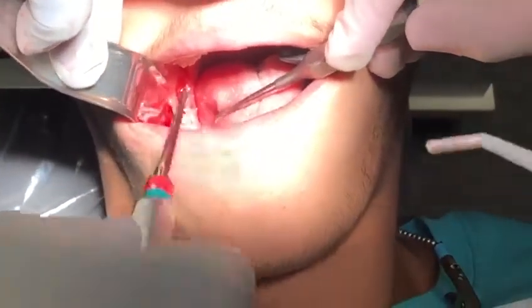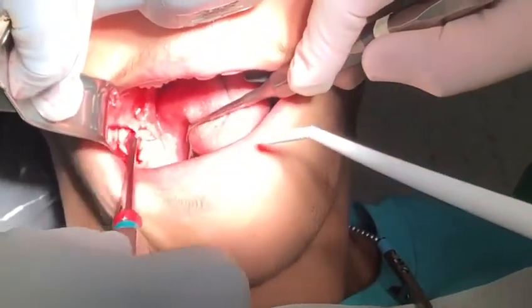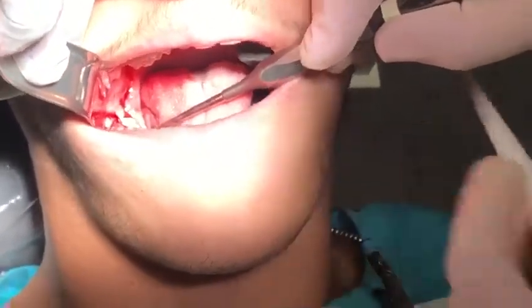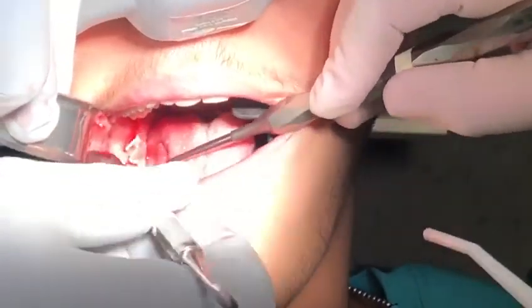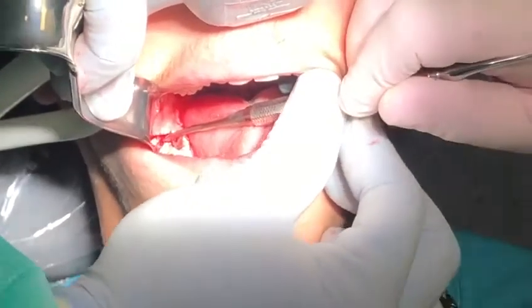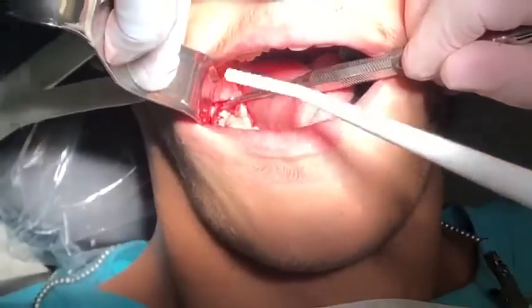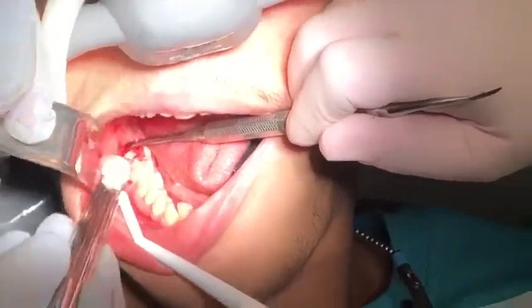Can you feel it? Try to lift it up at all. It's going to look like it's impacted — really tight — so let me have a look at it. See if you can hold this right here. Lots of water and a little vibration you're going to feel here. No worries — anything bothers you, raise your hand. Let me know. Here you go, let's clean this out.